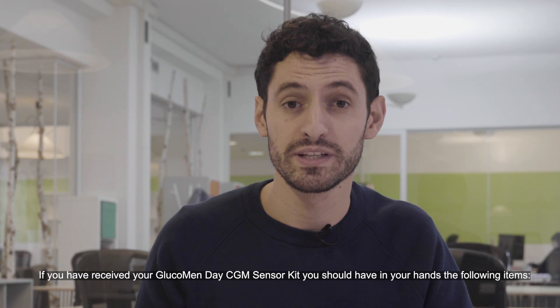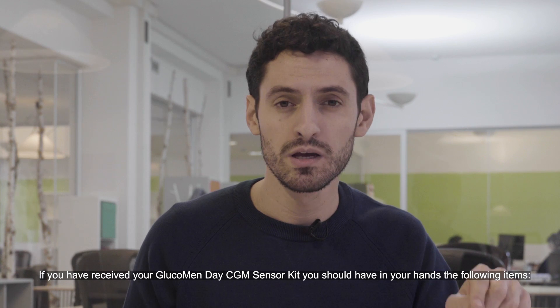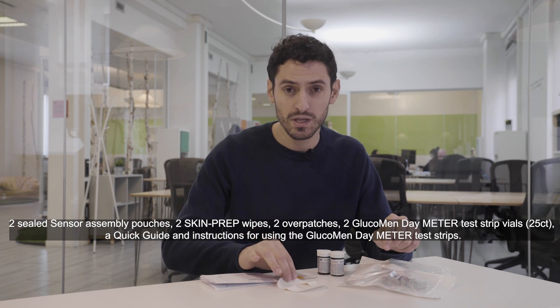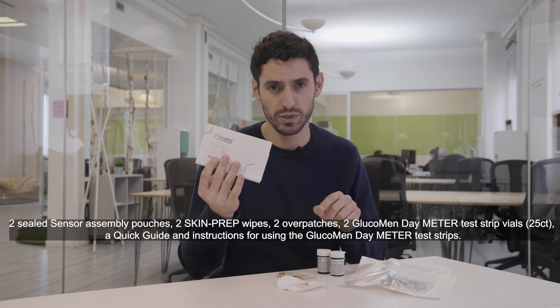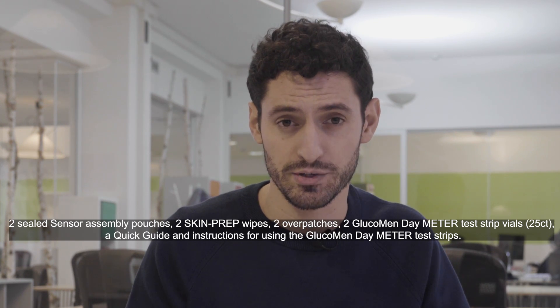If you have received your GlucoMen Day CGM sensor kit, you should have the following items: two sealed sensor assembly pouches, two skin prep wipes, two over patches, two GlucoMen Day meter test strip vials, and a quick guide and instructions for using the GlucoMen Day meter test strips.